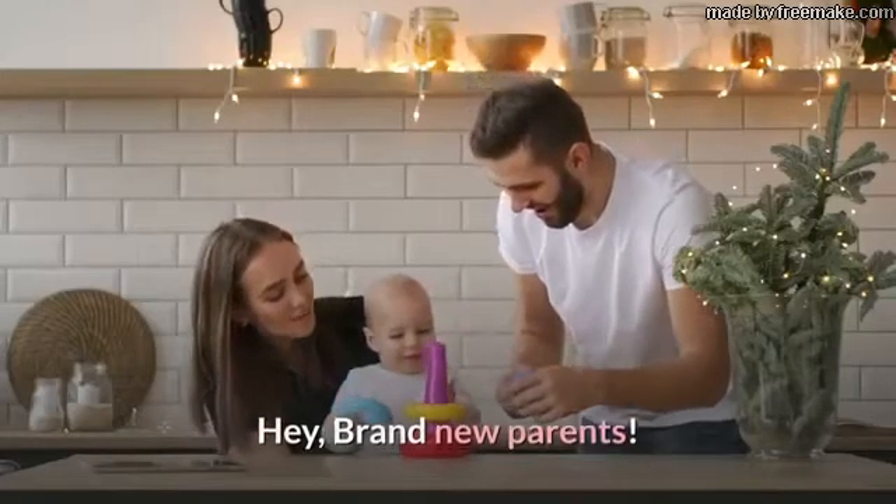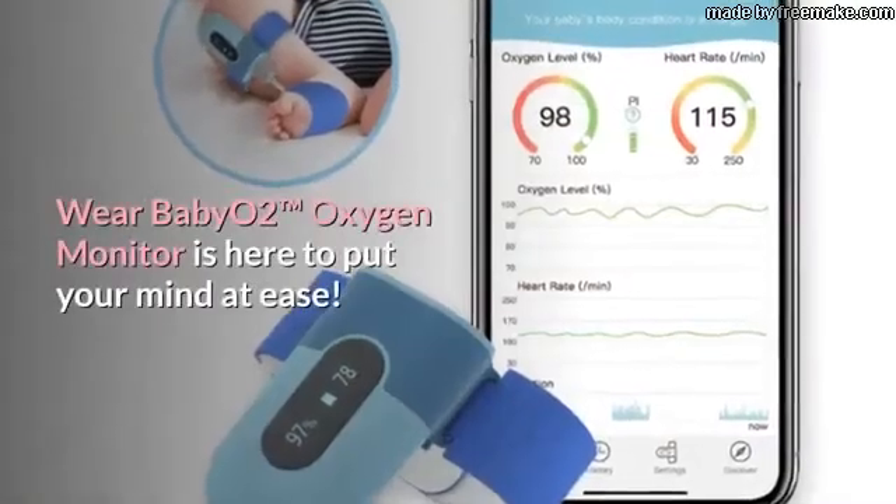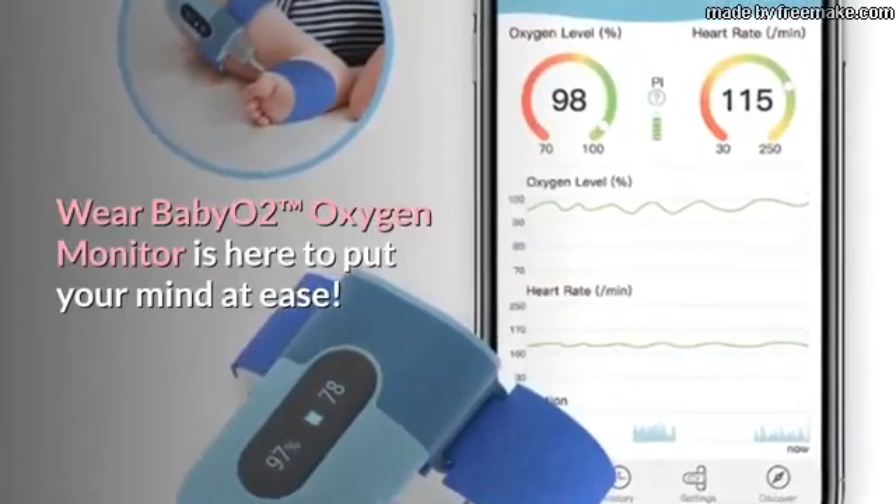Hey, Brand New Parents! Do you feel tricky about BabyGuard? Wear Baby O2 Trademark Oxygen Monitor is here to put your mind at ease.